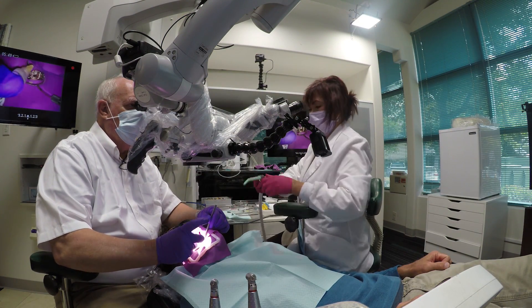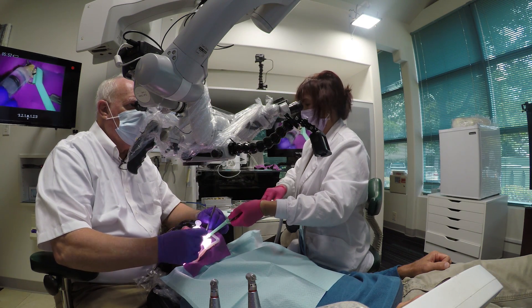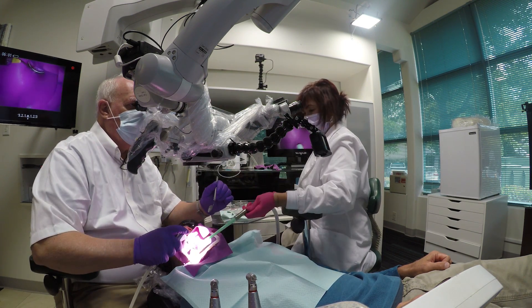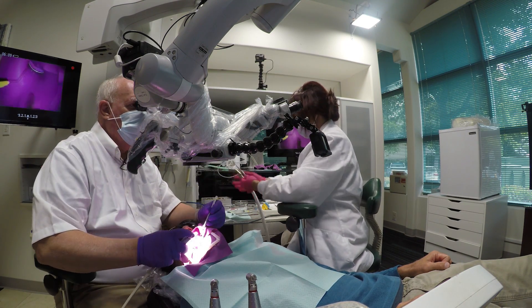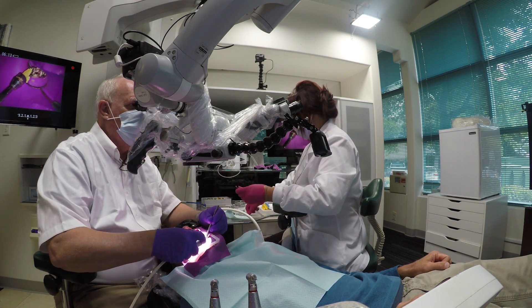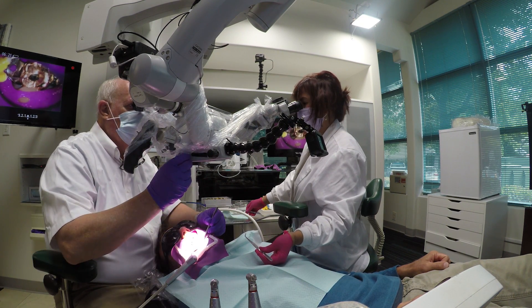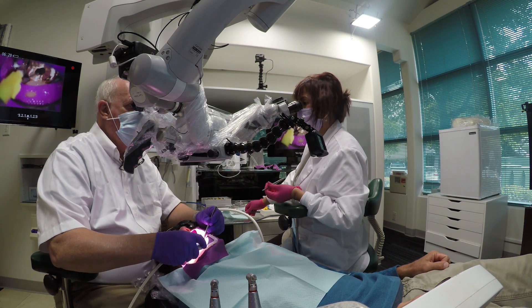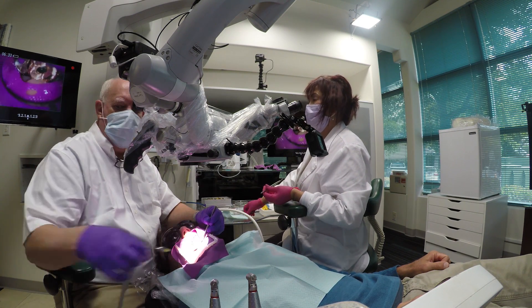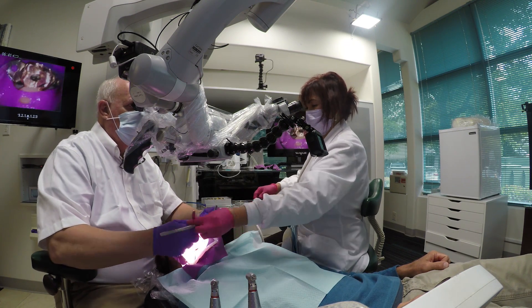So here's kind of the review from different angles in the operatories. You can get some sense of the rhythm. It's very easy for me to go to my air-only stropco and mini air and water stropco. I don't like to tie my assistant up with having to suction into the canals and that sort of thing.